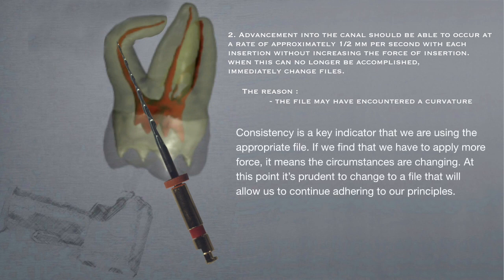Consistency is a key indicator that we are using the appropriate file. If we find that we have to apply more force, it means the circumstances are changing. At this point, it's prudent to change to a file that will allow us to continue adhering to our principles.